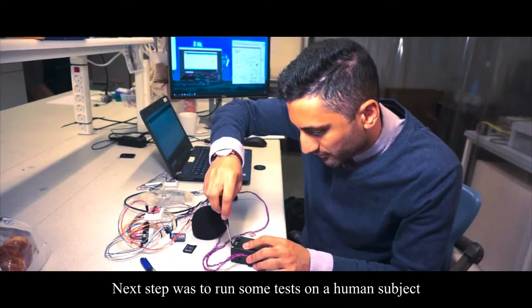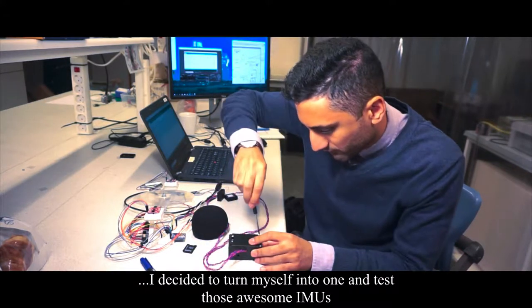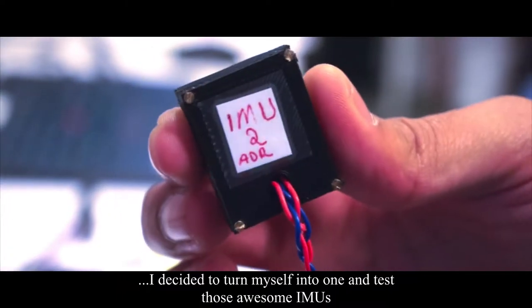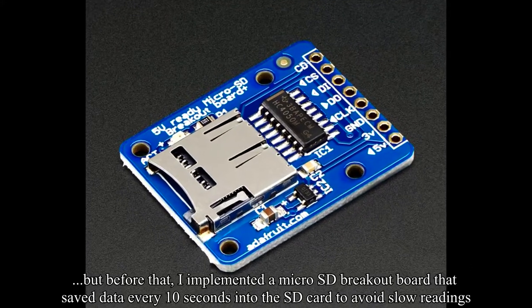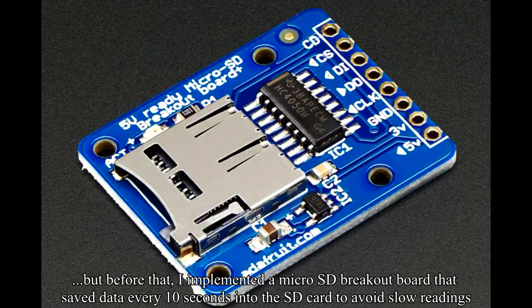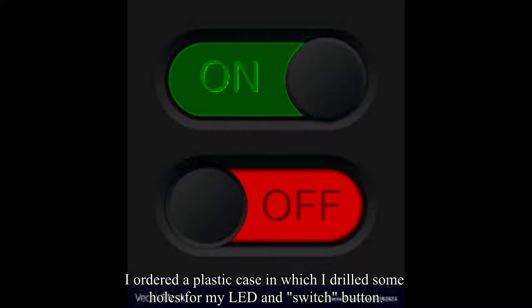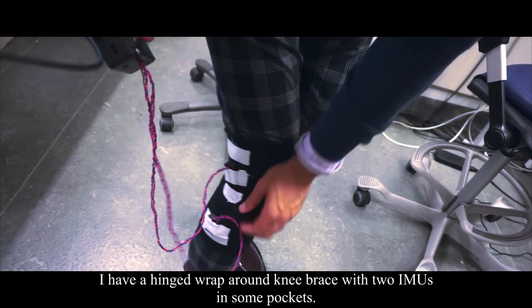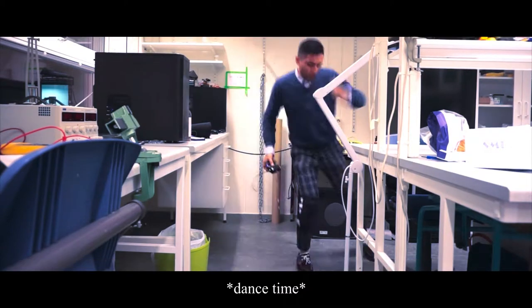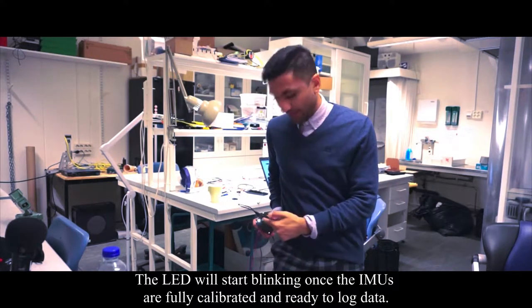The next step was to run some tests on a human subject. Since I couldn't find a guinea pig, I decided to turn myself into one and test those IMUs. But before that, I implemented a micro SD breakout board that saved data every tenth of a second to avoid slow readings. I ordered a plastic box, drilled some holes in it, and added a light-emitting diode and a switch button to pause and record data.